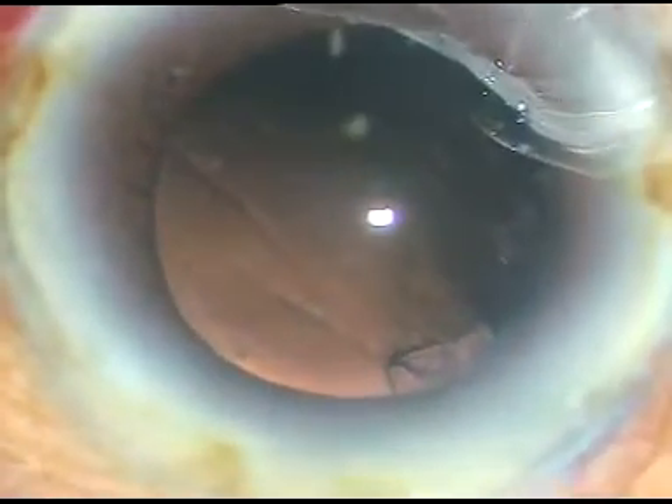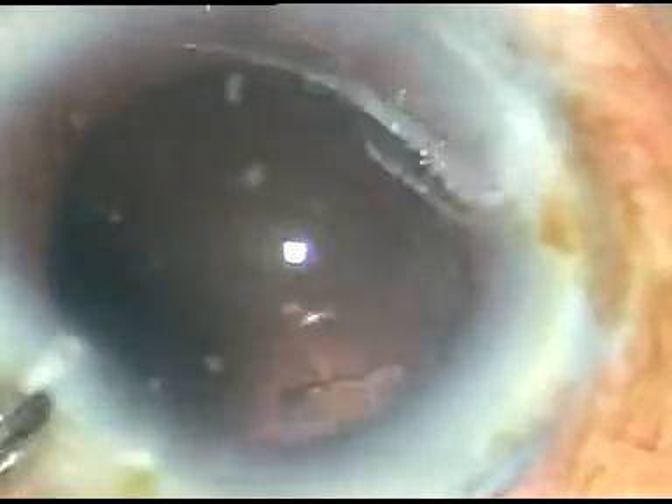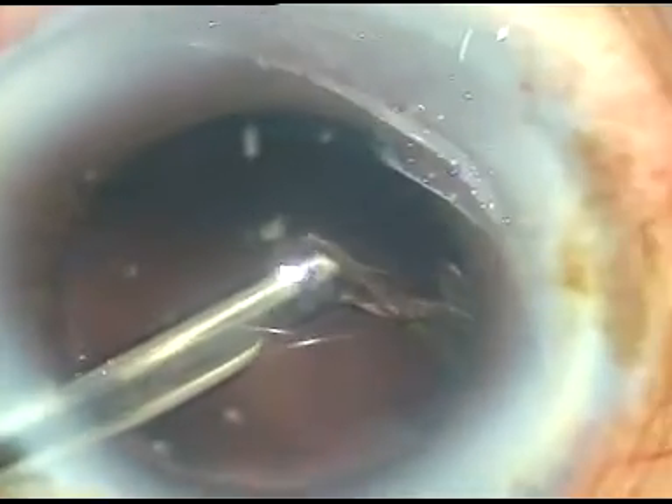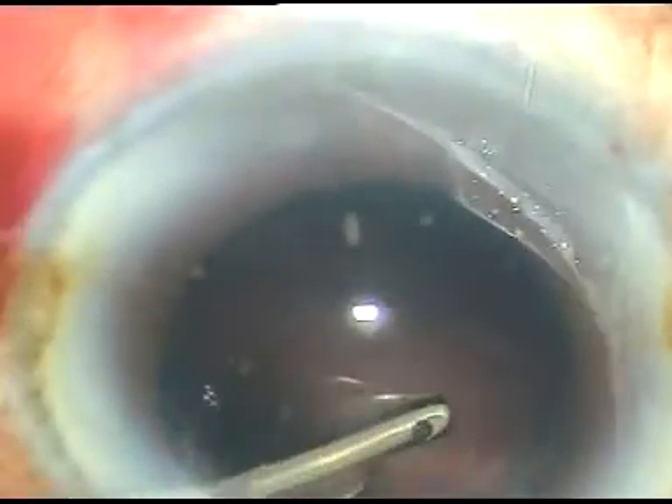This cortical lens matter is aspirated very easily with the Simcoe cannula. In such hard cataracts, the posterior capsule is usually clean — there are no cells sticking to the posterior capsule.